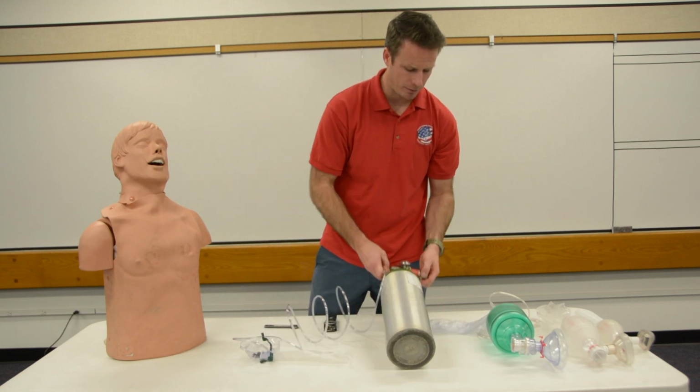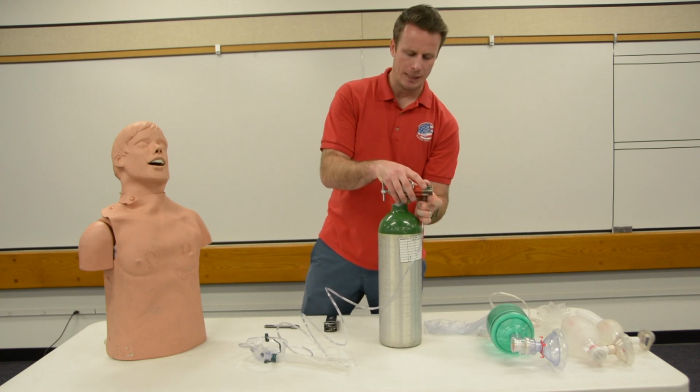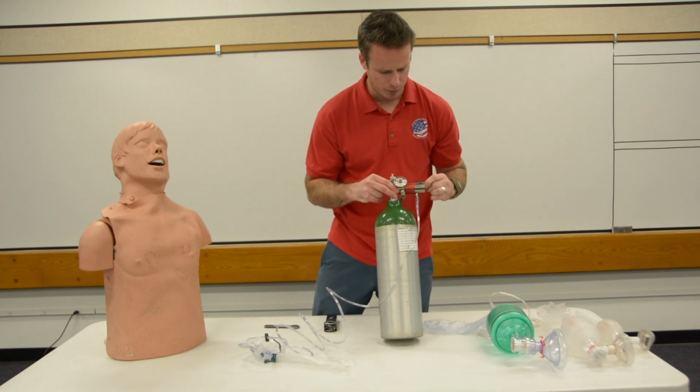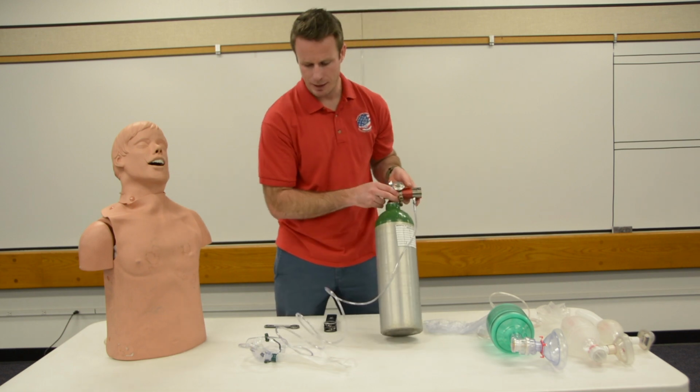So in order to use this, my flow rate is actually going to be 10 to 15 liters per minute. So I'm going to stand up my oxygen tank. I'm going to connect my tubing right back here. And I'm going to turn it all the way up to 10 liters per minute. Once I've got my oxygen tank on 10 liters per minute, I'm going to lay my tank down.